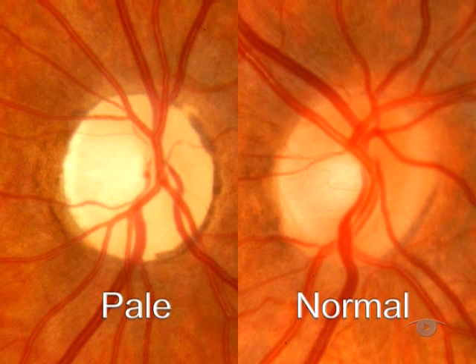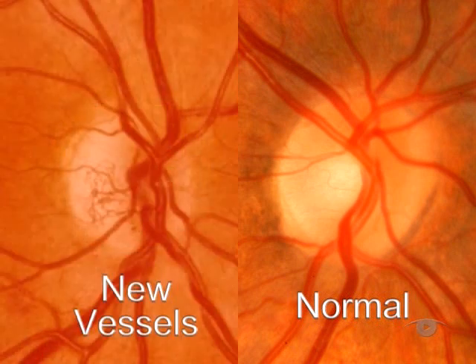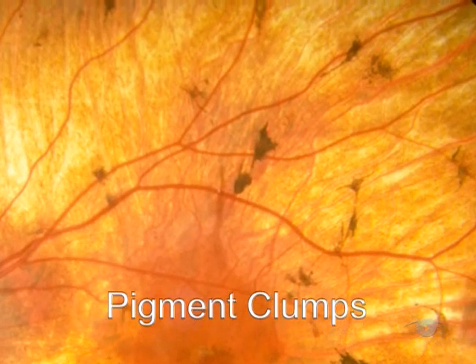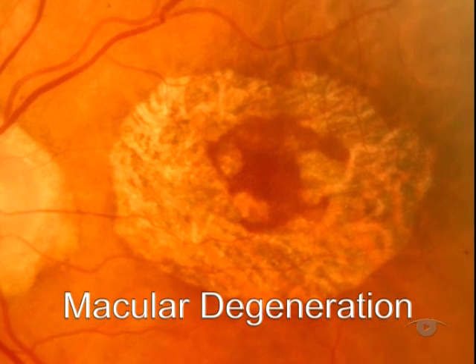Here's a pale atrophic disc that you often see in multiple sclerosis or following optic nerve trauma. This disc is swollen with a blurred margin — one important cause of this is raised intracranial pressure. Here's a disc that has an enlarged cup, characteristic of advanced chronic glaucoma. You may also see the growth of new disc vessels in proliferative diabetic retinopathy. Aggregation of pigment granules in the peripheral retina is typical of retinitis pigmentosa, and the central retina is the area affected by age-related macular degeneration, which is of increasing prevalence in our ageing population.